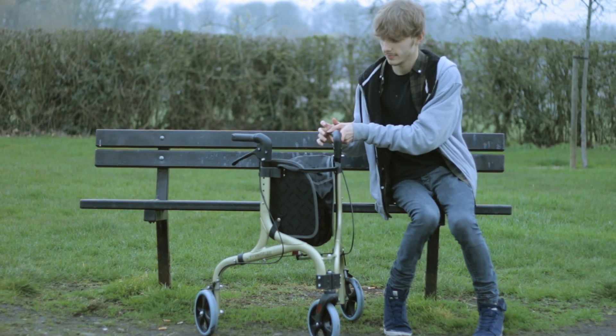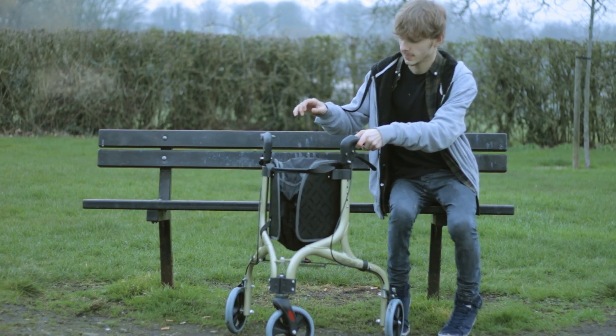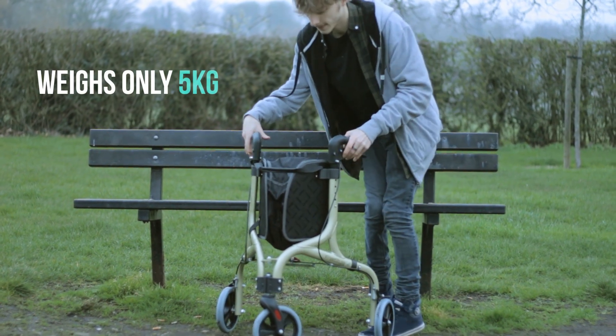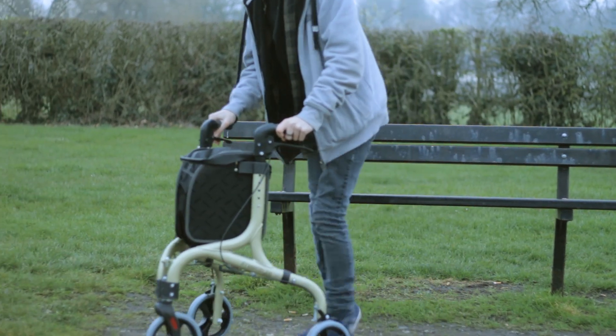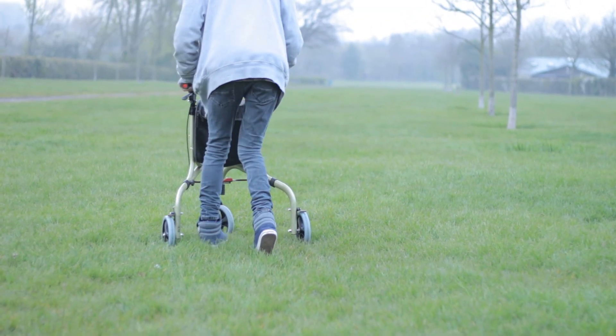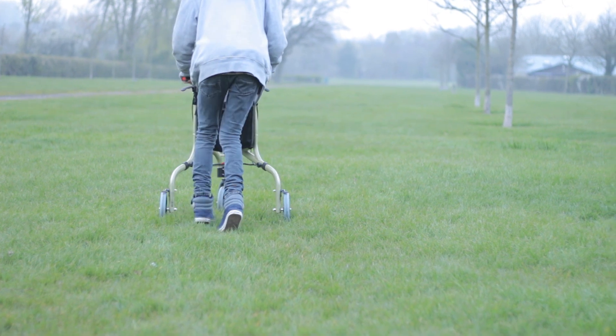The rollator can be used indoors and outdoors. It weighs only 5kg with a strong aluminium frame. The maximum user weight is 18 stone and it comes in either colour champagne or silver.